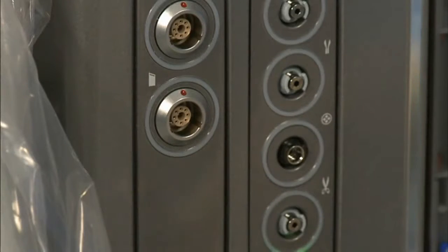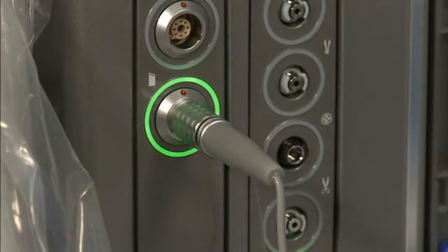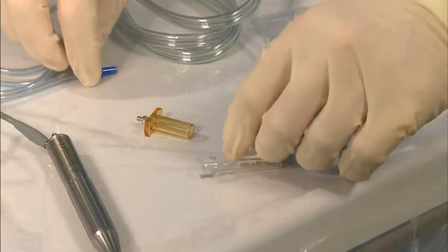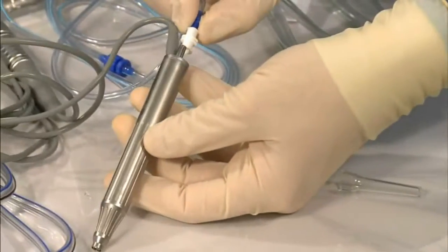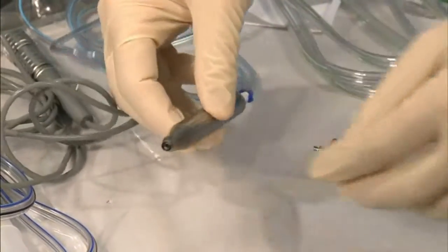Connect the fragmentation handpiece electrical connector to the ultrasound handpiece port on the console by lining up the red dots and inserting. Note that the fragmentation handpiece is automatically selected in the handpiece panel of the setup screen. Next, connect the female-to-female connector to the light blue extrusion line. Connect the other end of the female-to-female connector to the fragmentation handpiece.